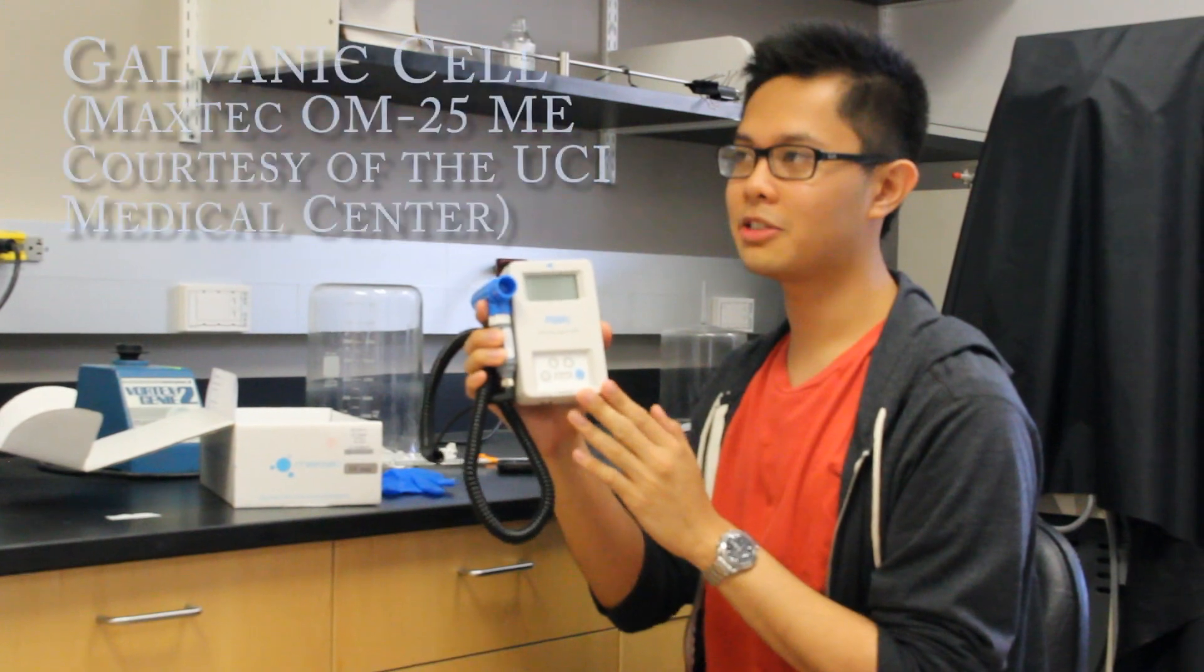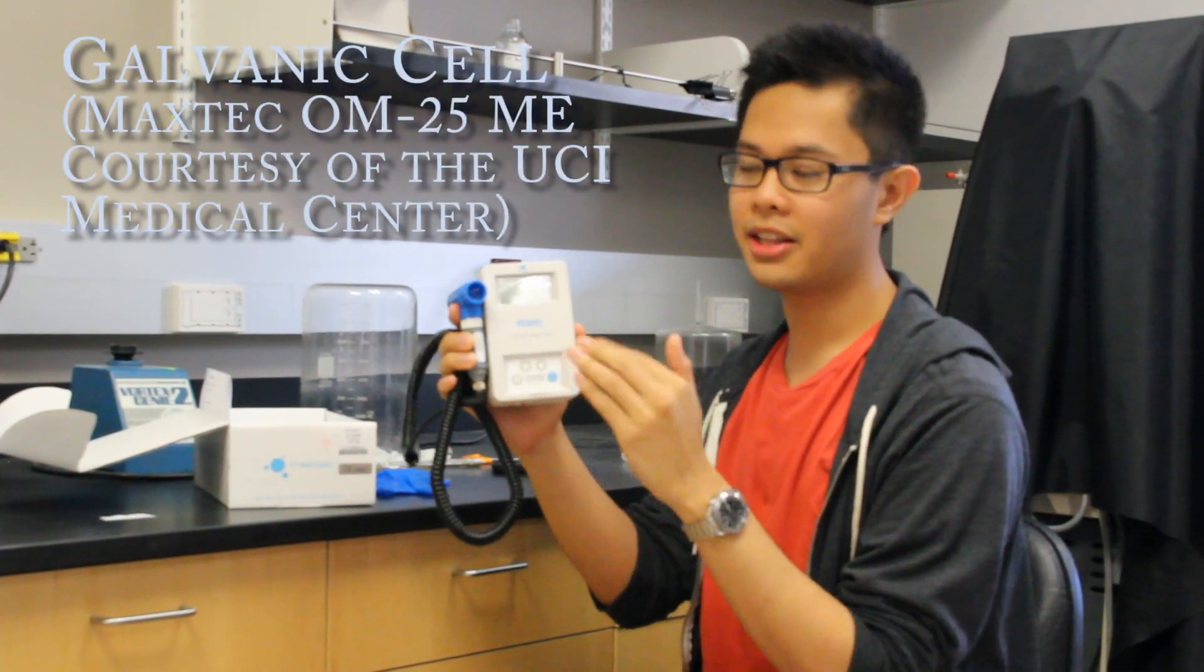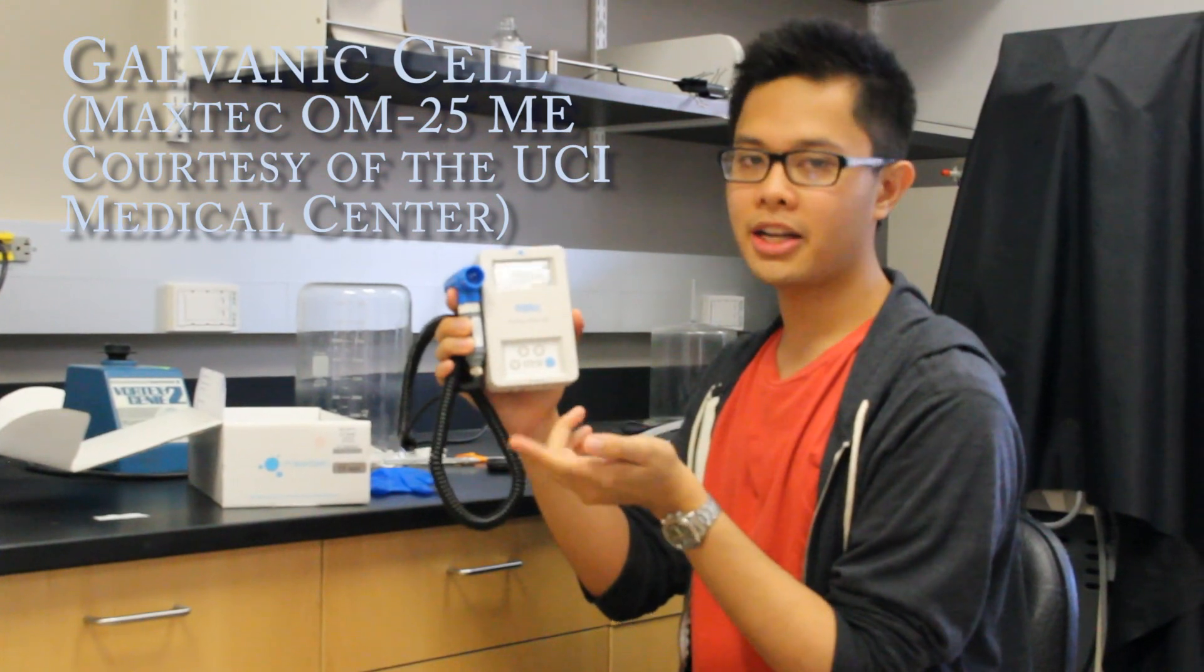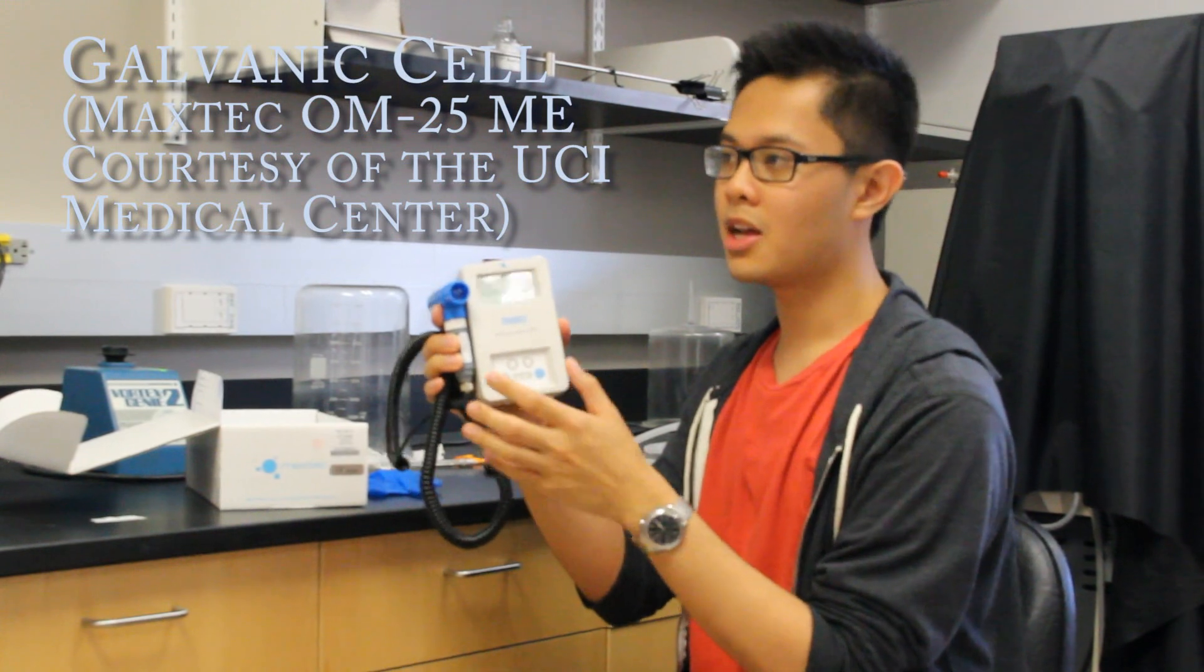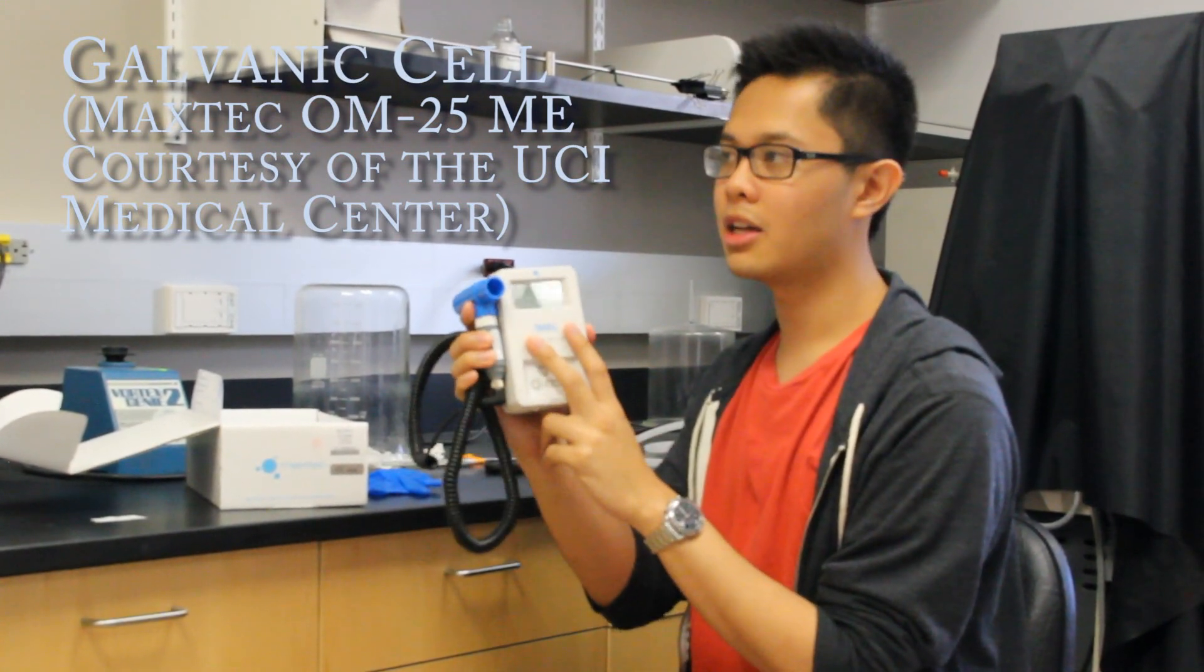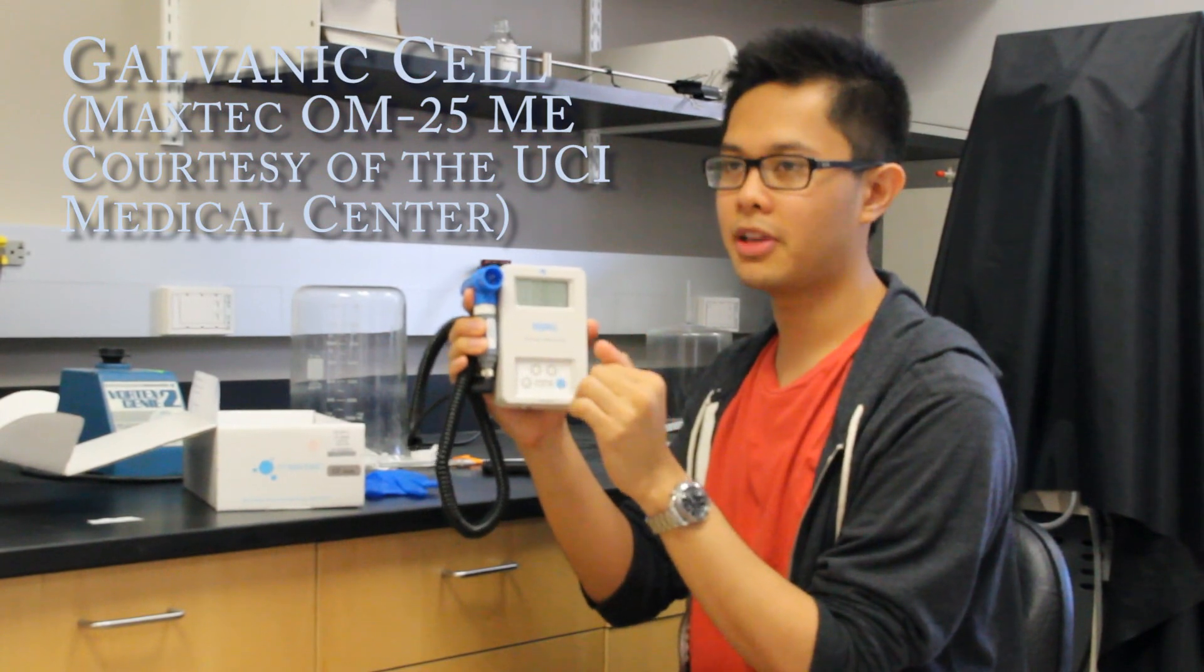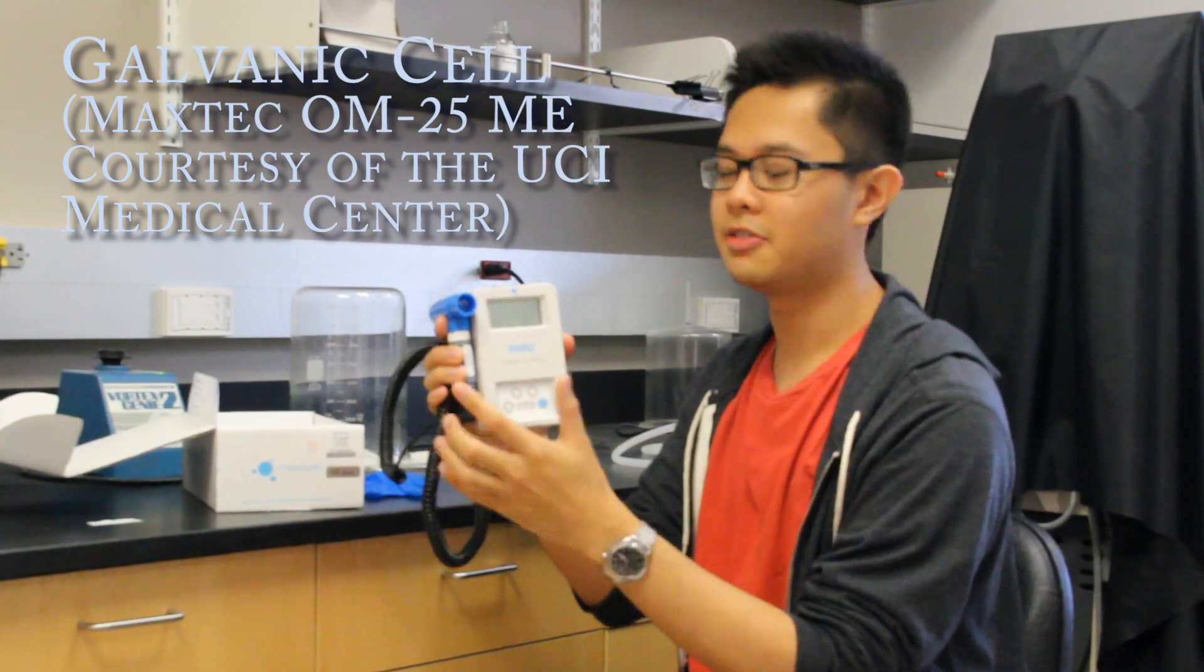Galvanic oxygen sensors essentially work by a chemical reaction within the galvanic fuel cell, the cathode and the anode, and that's because of the exposure of the potassium hydroxide to the air. The current created is dependent on the partial pressure oxygen produced, and we can measure that oxygen based on the current. This particular model is $400, and it has a response time of 15 seconds, and it's accurate within 90% of the actual oxygen in its environment.